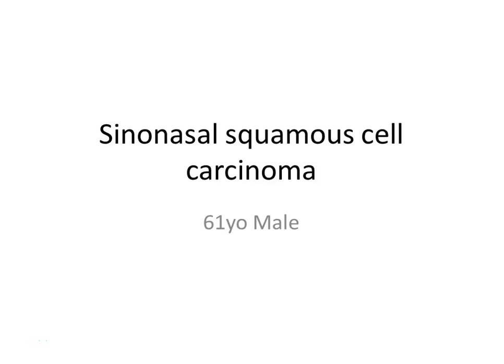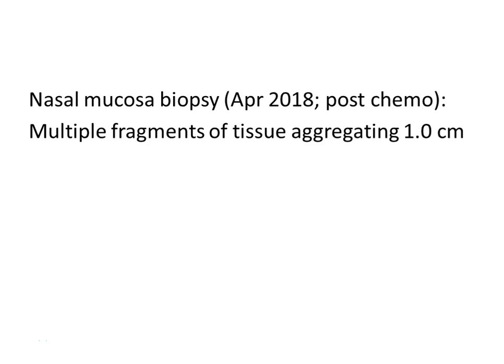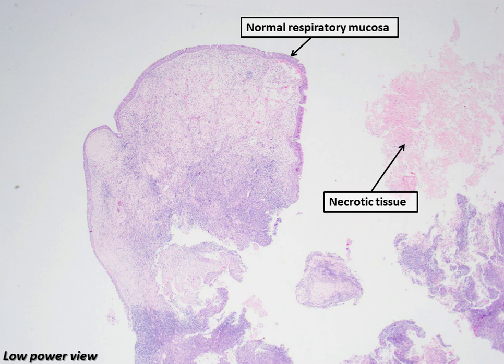This is a case of a sinonasal squamous cell carcinoma in a 61-year-old male. We received a nasal mucosal biopsy composed of multiple fragments of tissue aggregating 1 cm in maximum dimension. It is to note that the patient had previous chemotherapy done.